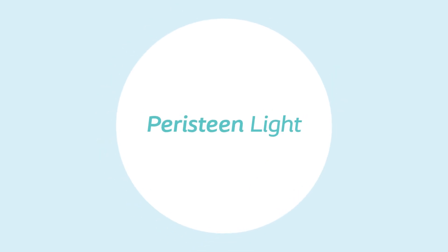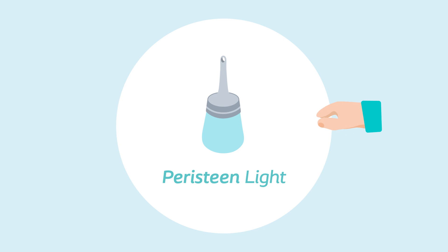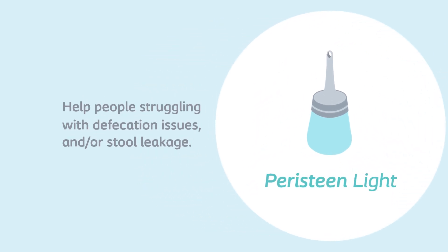In this film, you will learn step by step how Peristeen Light can be used to help manage faecal incontinence and or constipation. The product is intended to help people struggling with defecation issues and or stool leakage.